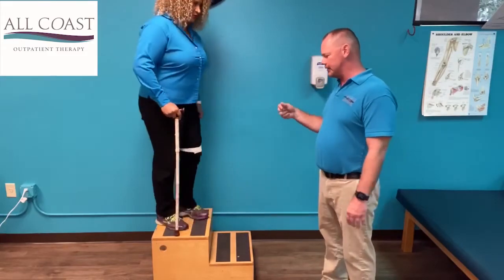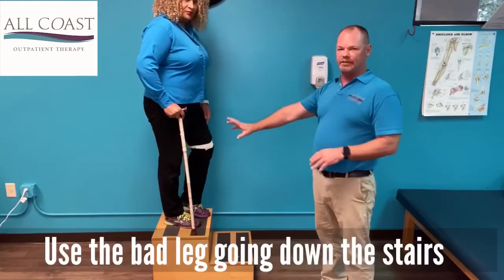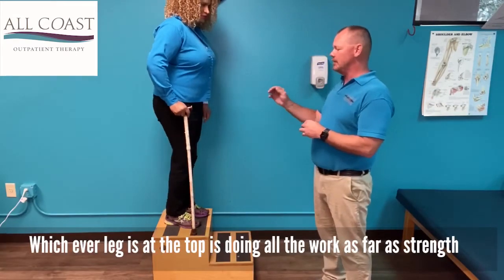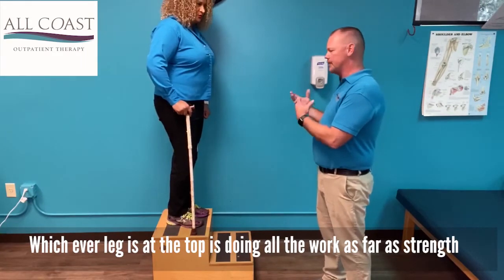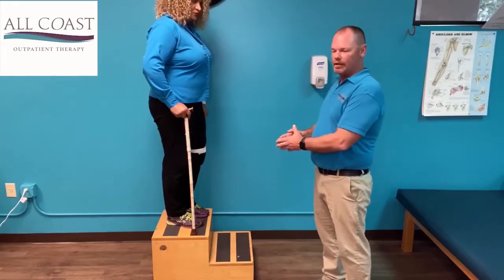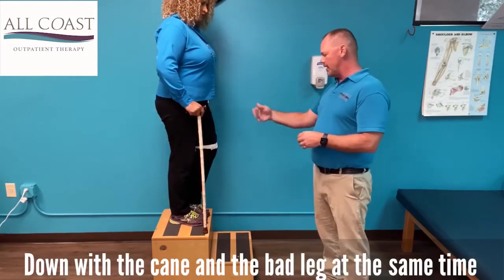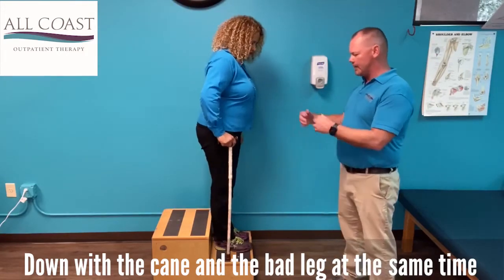Turn around and we're going to go down the steps. You're going to go down with the bad leg because you want the strong leg to be higher than the weak leg. Whatever leg is up top is doing all of the work as far as strength — when you put your leg up, you have to lift your other leg up. And when you're going down, you have to lower the bad leg down while the good leg is up at the top. So you go down with the cane and the bad leg at the same time, then come down.